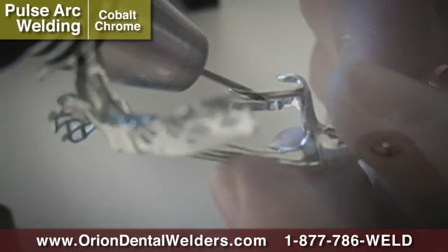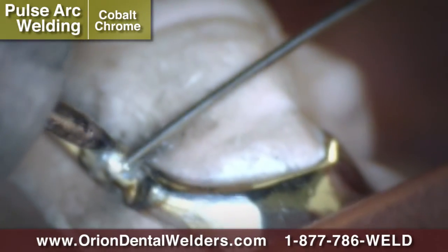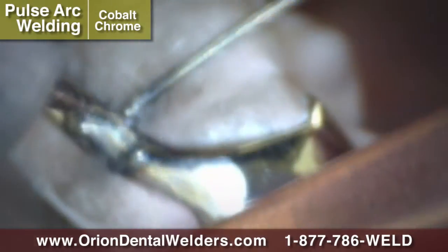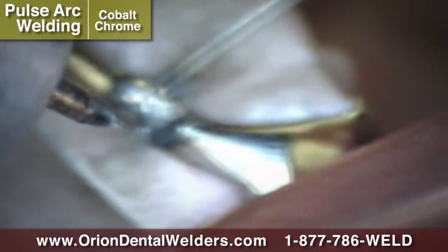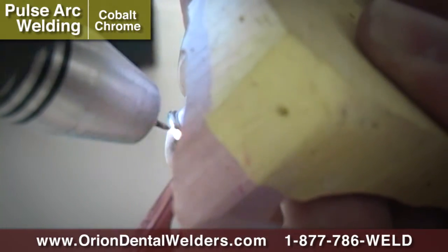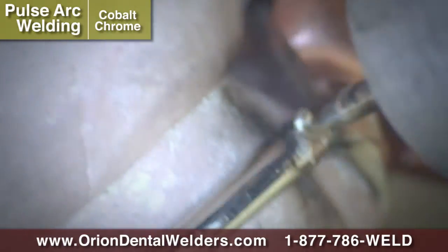If the clasp joint has experienced any shrinkage during the welding process, it may be helpful to add fill wire to the joint. After additional material has been added, the material can be smoothed by re-welding the area.